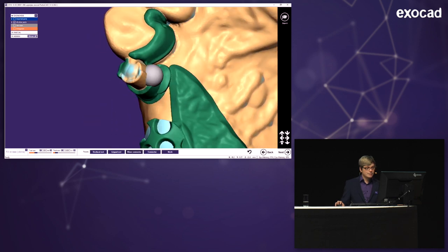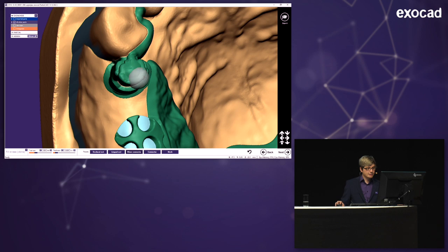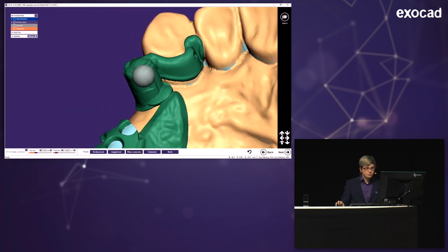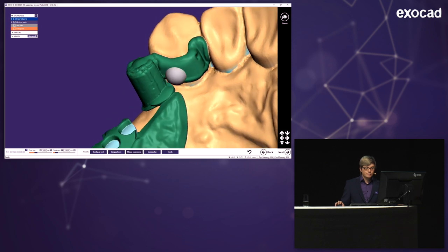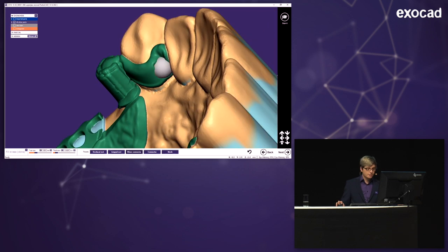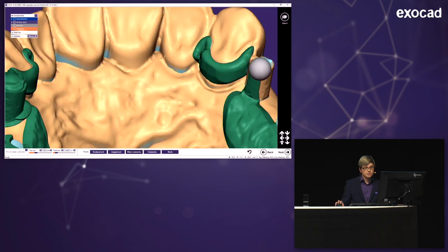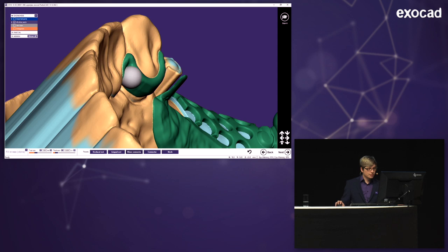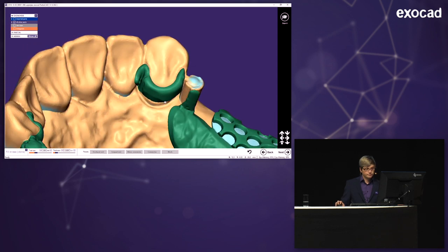So this way, I can be absolutely sure that it will fit, that there won't be any gaps in the end. So it may look a little bit weird, but it will look good in the end. And the same thing I'm doing here with those parts. If there's a hole in it, there's none. So I'll leave it like it is. Here, there's a small one. So I'm just filling up a little bit to be sure it fits. And I add some material all around here.